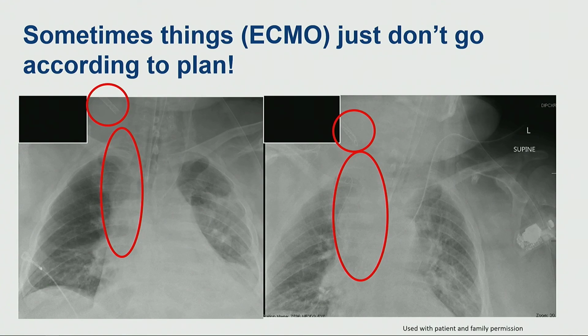There was a cardiac arrest. The patient was emergently resuscitated, and a left femoral venous cannula was emergently and efficiently placed. Kudos to the team that jumped on this within minutes and got the patient recannulated. So the patient then got bilateral femoral cannulas just as a rescue procedure so we can maintain circulation.